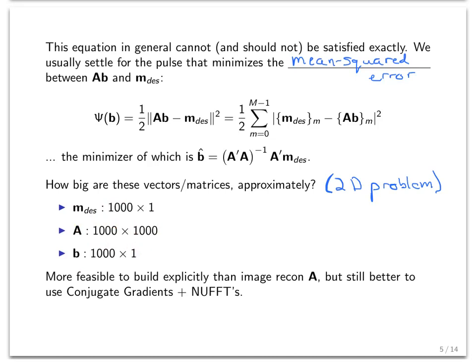So it's actually a little bit smaller in practice than image reconstruction problems. It's not an order of magnitude smaller, but it's somewhere between 1 and 10 times smaller than your typical image reconstruction problem. So we can usually solve these problems quite a bit faster than a normal iterative image reconstruction.